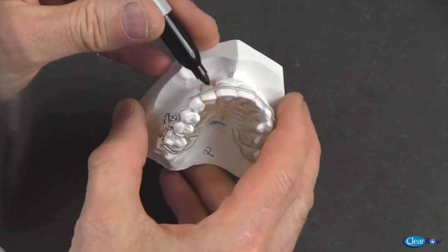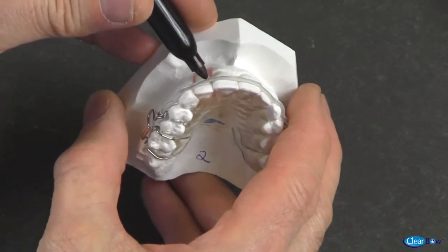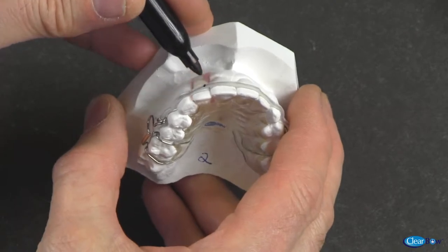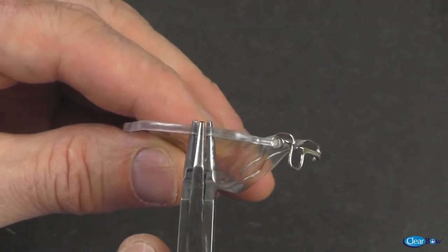The clear bow will now be bent using three-pronged pliers to contact the mesial labial corner of the rotated lateral. A black dot is marked on the clear bow to make the bend more visible.